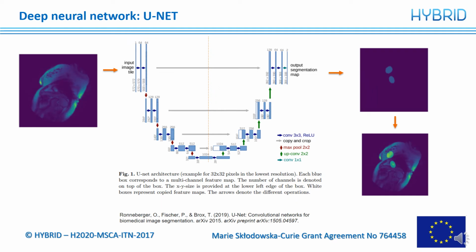Regarding the network of the model that we want to use for this task, we went for the U-Net, since it has been showing promising results for more than 5 years in the field of medical image processing. The name of this network is due to the shape of the structure, and it can be split in 2 parts. The first one is the encoder, where with a reduction of the dimensionality, it obtains the main features regarding the input and this specific task.